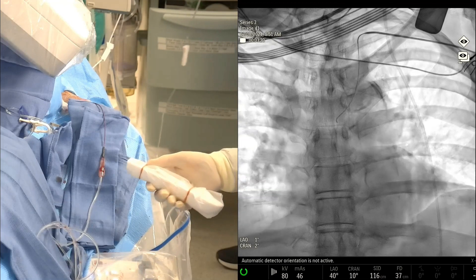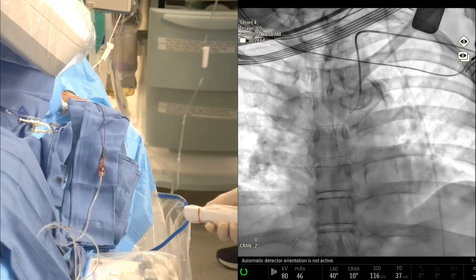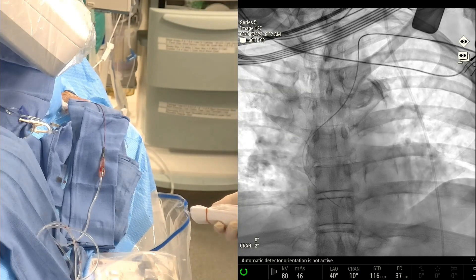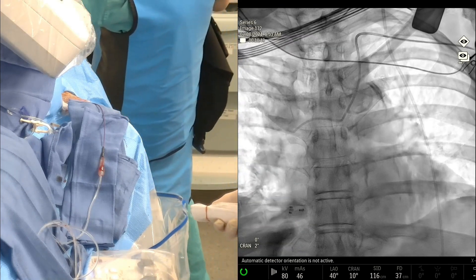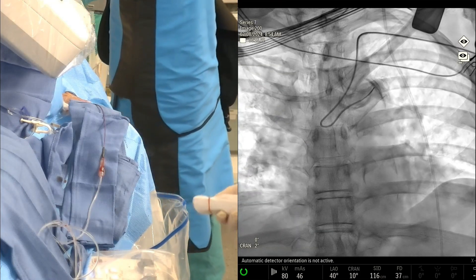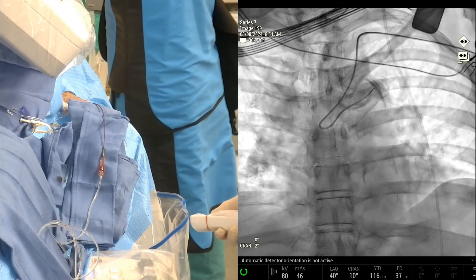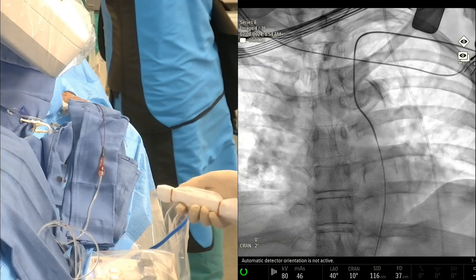You can see the calcification on the aorta here. When we see that, we often will switch very quickly to a Simmons catheter — we usually use a Simmons 1. In that scenario, we put down an exchange wire; in this case we used a Benson wire. We form our Simmons in the heart, as you can see here. Once it forms, we basically just pull it back and cannulate the descending aorta, advance our long wire — usually a Benson — and then we switch out for our diagnostic catheter, which in this case is the 130 Berenstein.